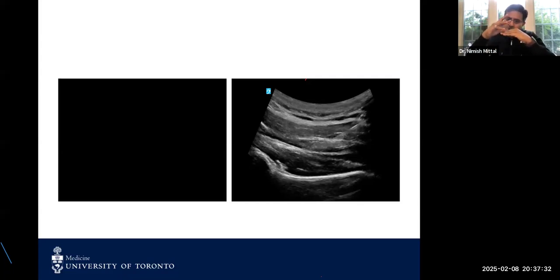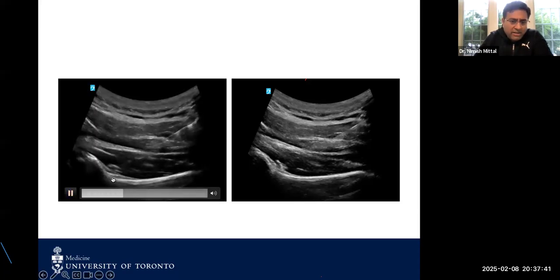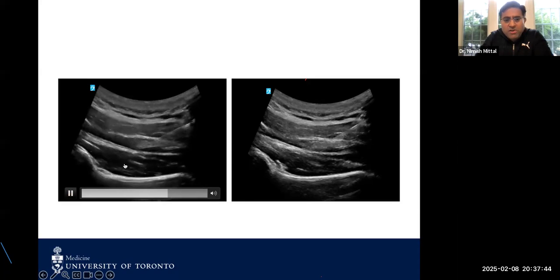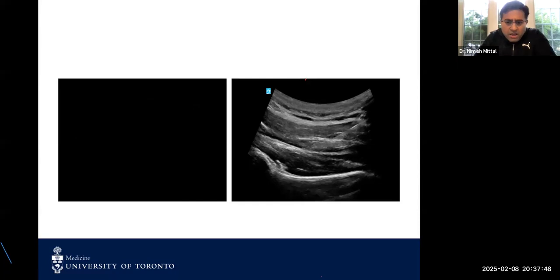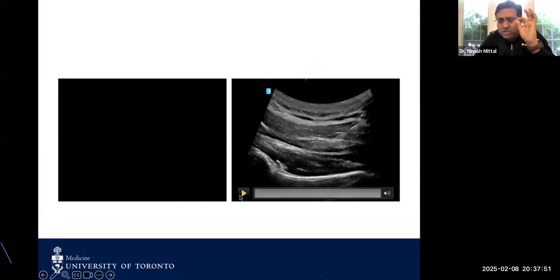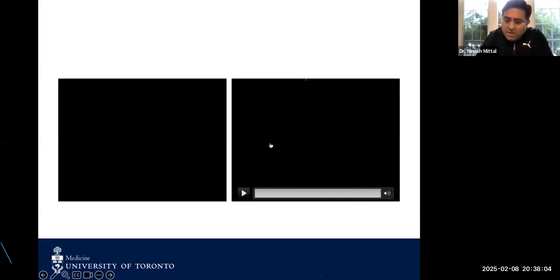If you're having your injectate spread in the muscle, that is not where the nerve is. And so again, if I play here, once I hit the needle in the corner, the injectate is spreading mostly around the muscle. So what I do is I then rotate my bevel, stick it on the bone again, and rotate it again in an attempt to puncture that fascial plane. And then after that, when I make an injection, you see it flows now around the fascial plane here. So it should not be blobbing in the muscle, but it should be going in the fascial plane. And you can see how the fascial plane then distends and comes up.